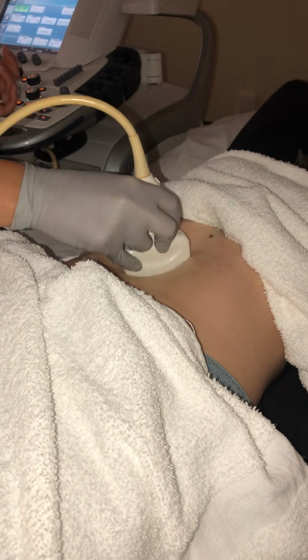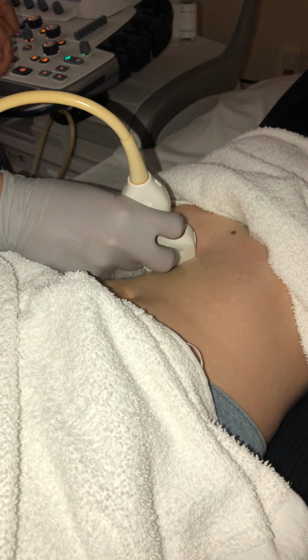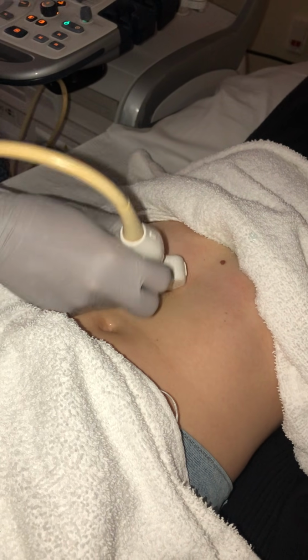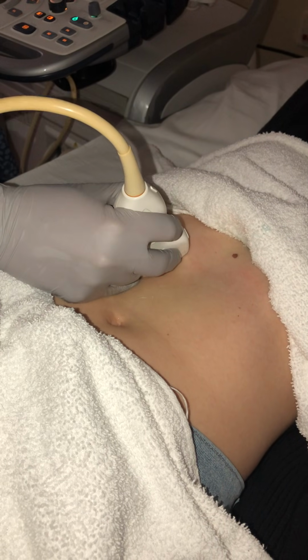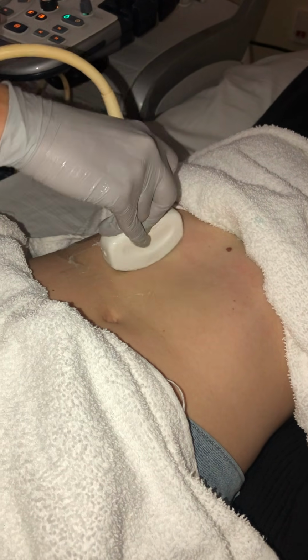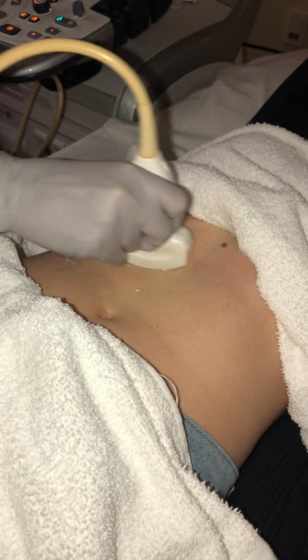So traditionally on most patients, you're gonna start with your sagittal plane of the gallbladder. We know that organ sits in weird positions, so we don't want to be strictly sagittal and transverse. We want to follow the sagittal and transverse of the organ. Because the gallbladder sits on an angle in the liver, we're going to mock that angle. So typically for a sag gallbladder, we're going to start with our transducer in that angled position.